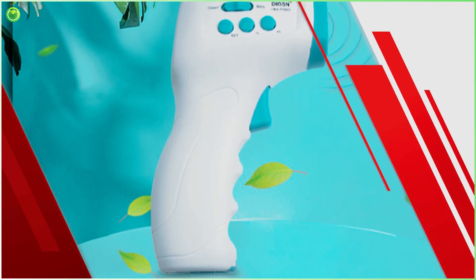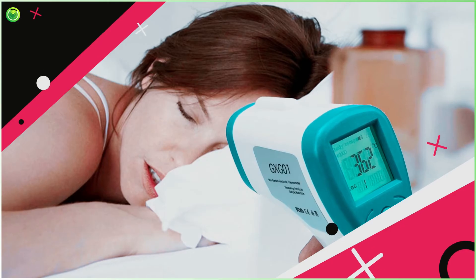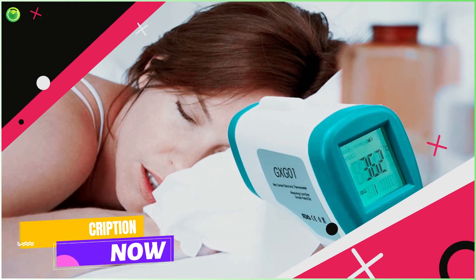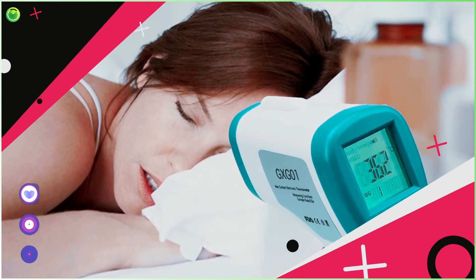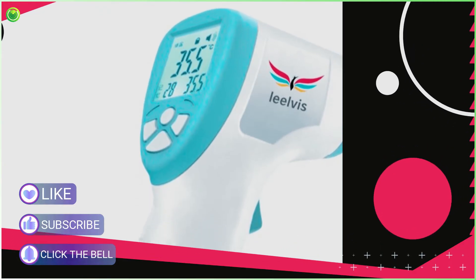Contact Method: Turn on the thermometer and dry the forehead of the patient. Now point the thermometer on the patient's forehead. Once the device records the temperature it will make a beep sound. Remove the device from the point and check the temperature.